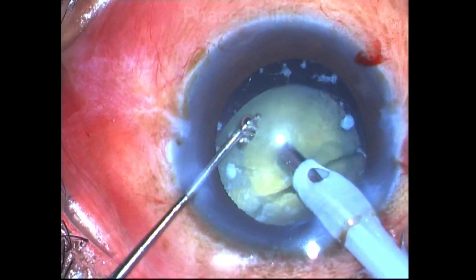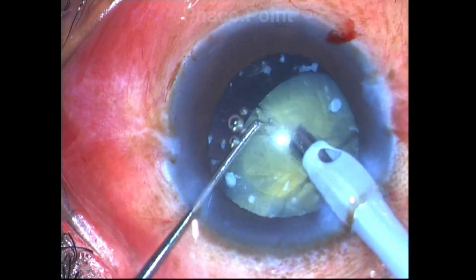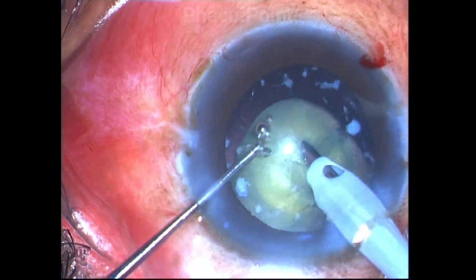The message I want to give here is: when you have these leathery cataracts which are small, you should always try to do a horizontal chop using a blunt chopper like this, or even a ball dialer.